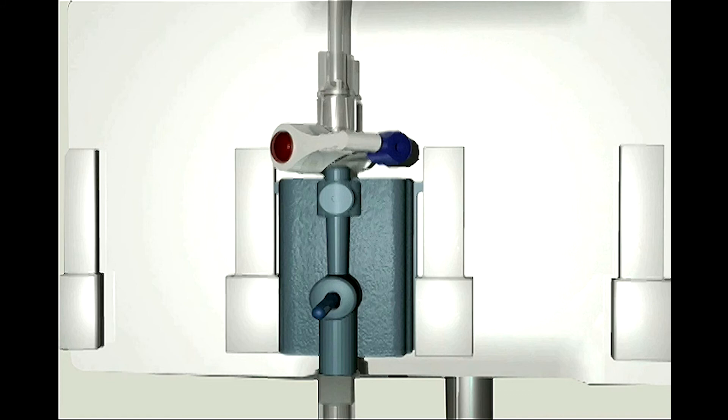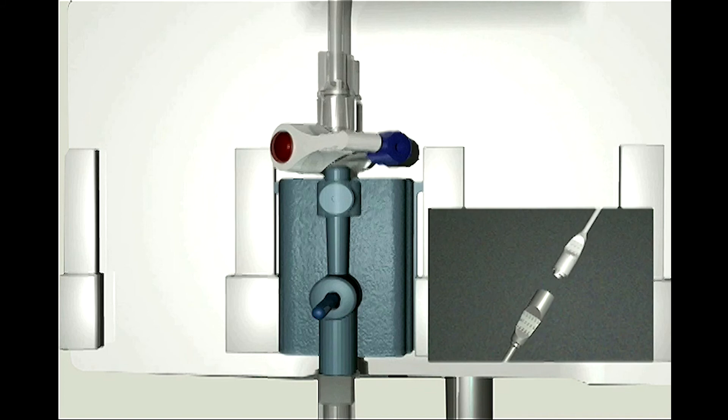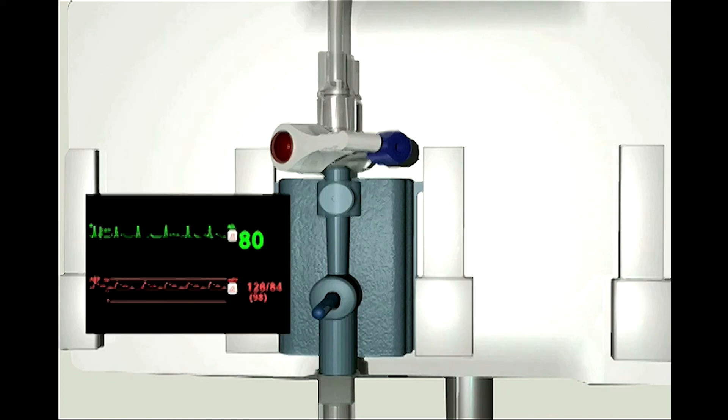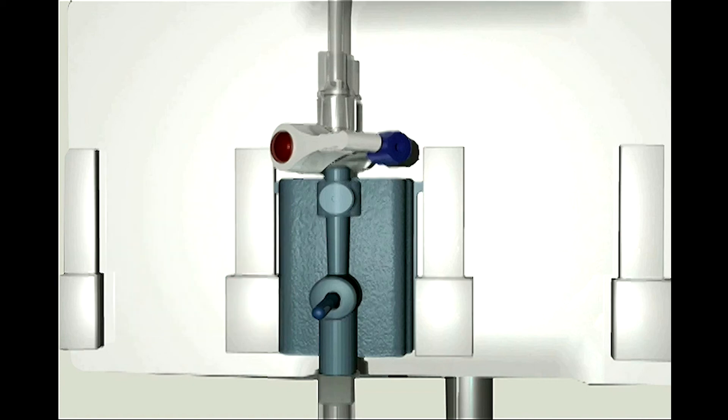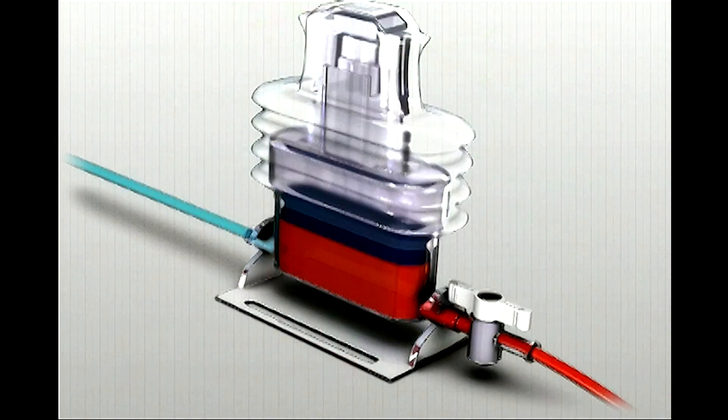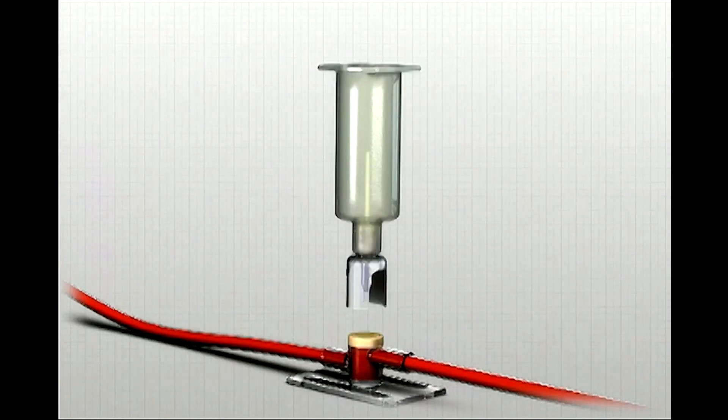The TruWave disposable pressure transducer is designed with the clinician in mind. From its ergonomic profile that fits in the palm of your hand to its cable connector that attaches and disconnects easily, the TruWave disposable pressure transducer provides high waveform accuracy and product reliability through a host of advanced design features. The TruWave disposable transducers can also be paired with VAMP kits for a complete and reliable closed needleless blood sampling system with accurate pressure readings in one complimentary unit.